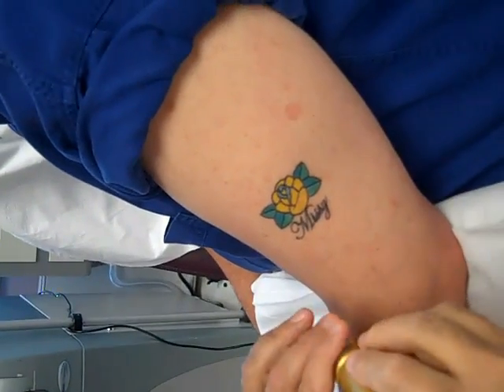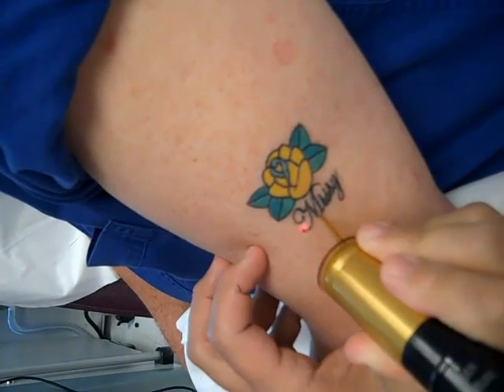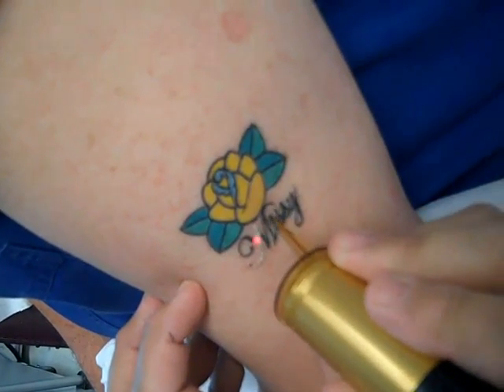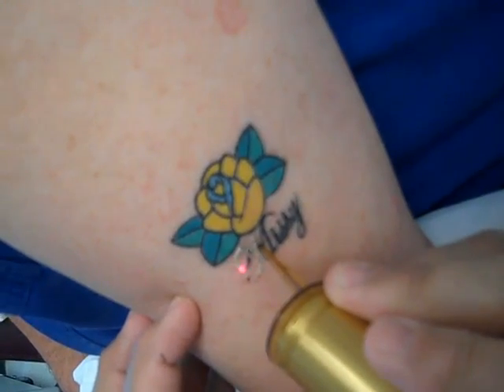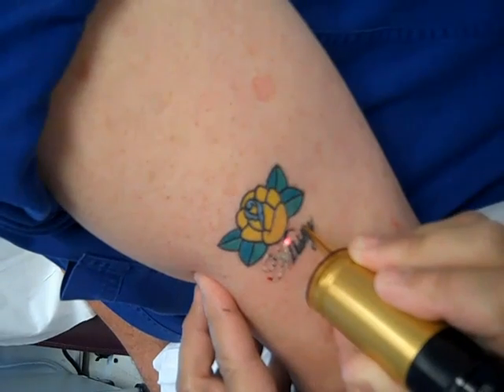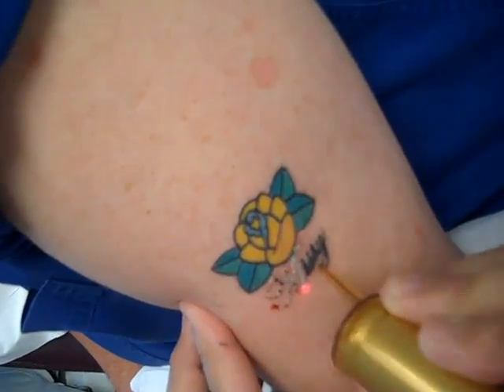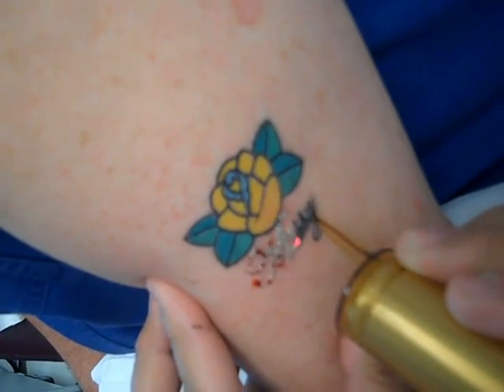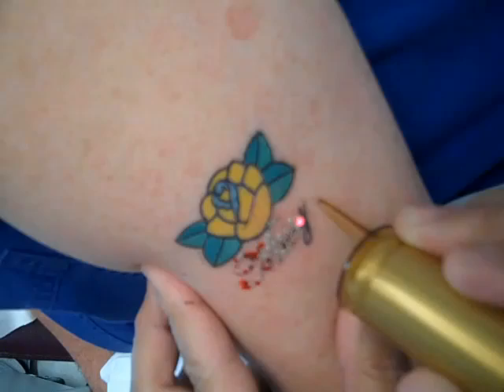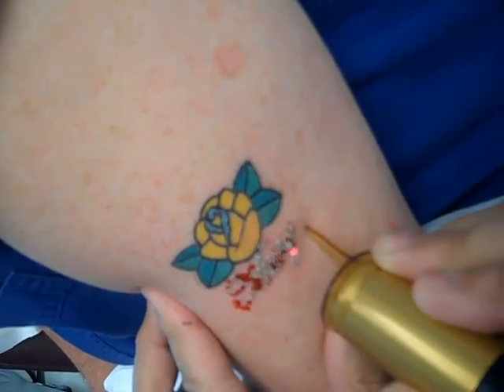Treat this with a 2mm spot size. We're going to treat just the name. Again, this is 755 nanometers. Alexandrite. A little bit of snap is good. We do a lot of this where we're removing names from tattoos. Little bit of pinpoint bleeding, which is fine. Means that it's penetrating nicely. Done.